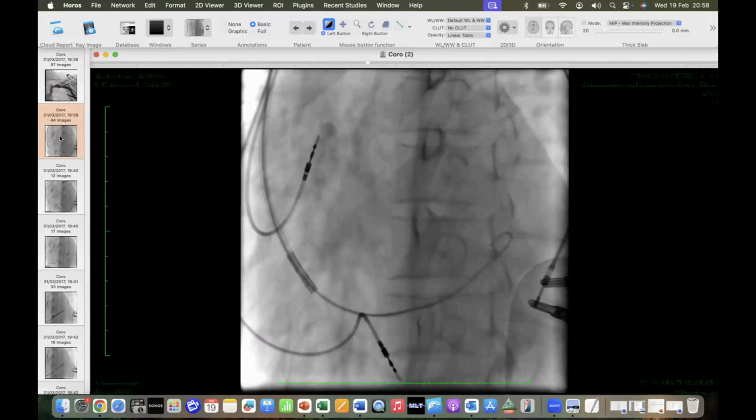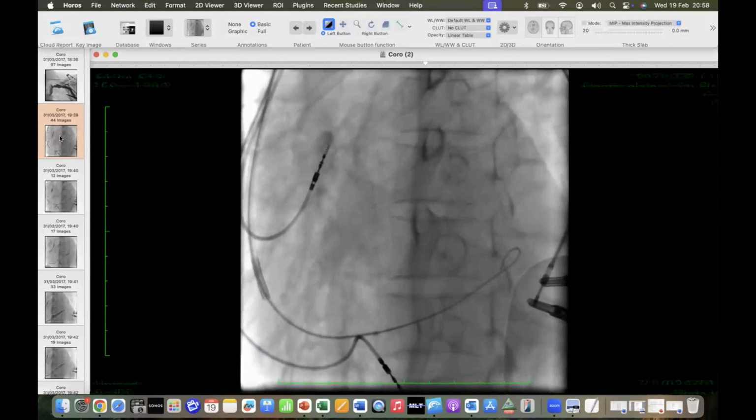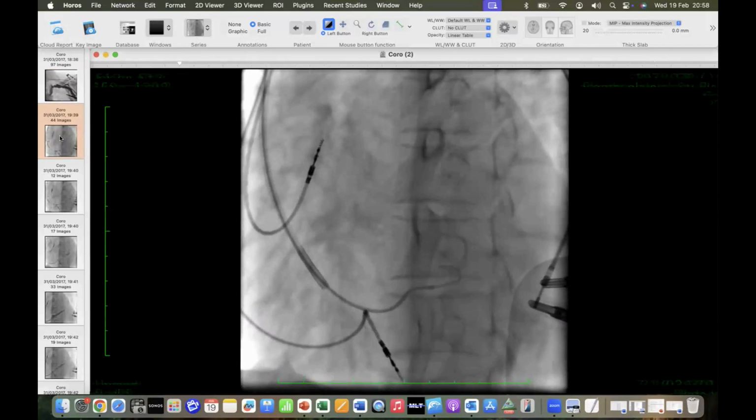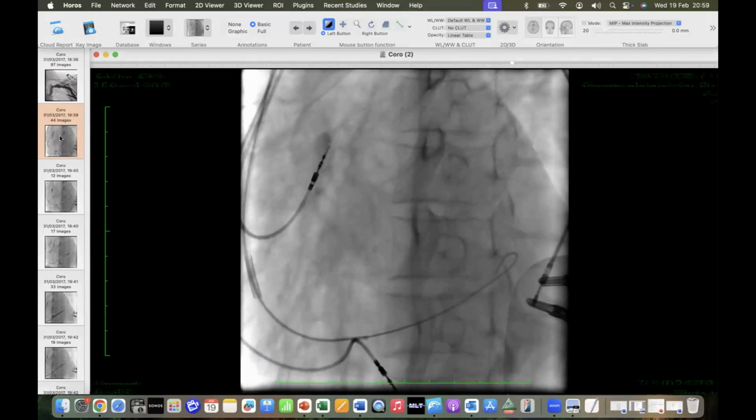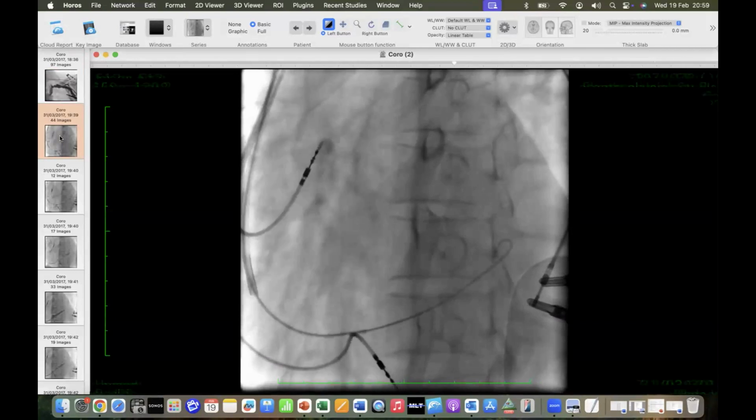Again, it's a dilated ventricle. You push the Amplatz catheter anti-clockwise, and then you advance the wire. You palpate it with the wire. What's happening here? The wire isn't going past a particular point. What's going on there, Dr. Hasham? It looks like it's encountered the valve there, Vieussens' valve. It's encountered a Vieussens' valve.